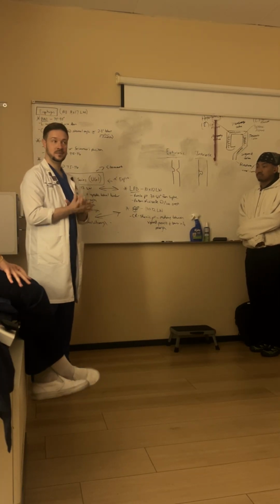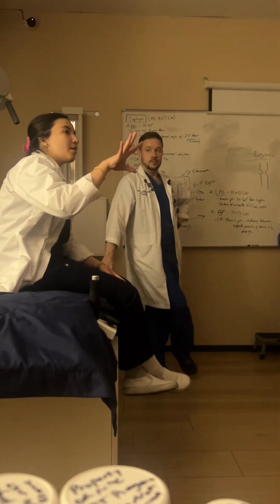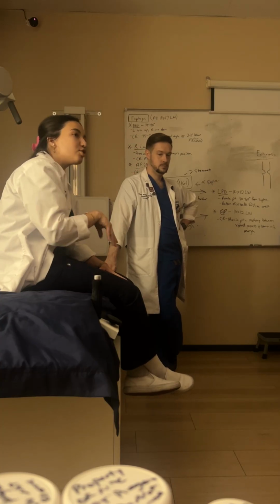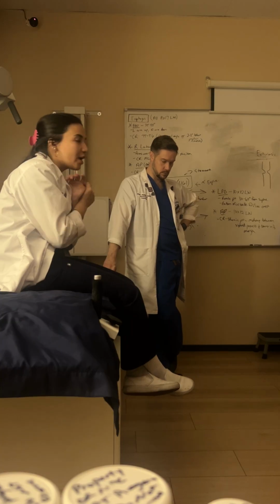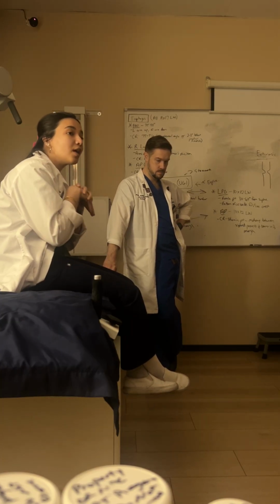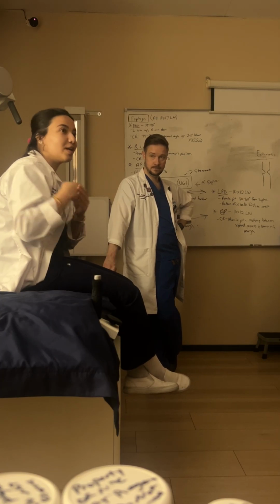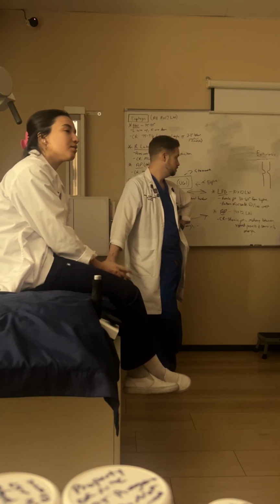Oh, also another thing. Your front desk is the one who gives them the laxatives, tells them the instructions, tells them they have to be NPO, all these things. So once they come to your department, you still go through your list of, okay, any past surgeries, are you NPO? A lot of the time they take NPO as just not food, but then they'll take their medication with yogurt, and it's like, okay, hold on. So now we have to go ask the radiologist if they did this, you know what I mean? So you have to go through a questionnaire with them still.